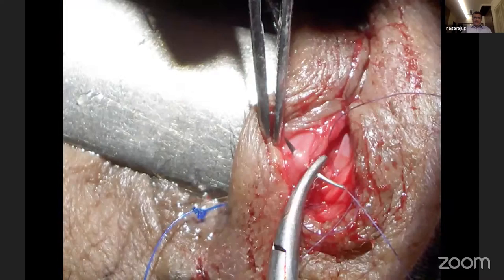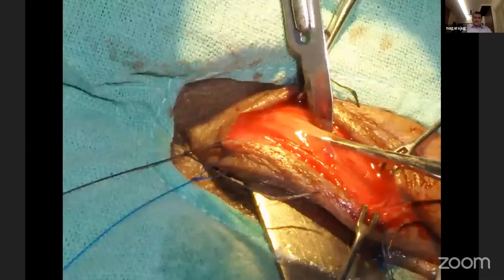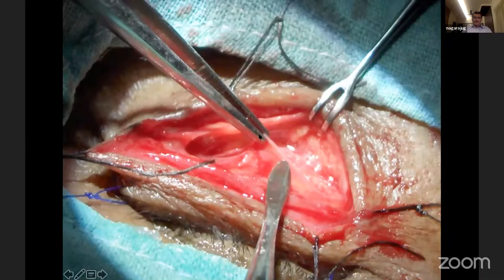And basically, when you identify the inferior retractors of the lids, you hold the lid with a non-toothed forceps, you hold the inferior retractors here, and you ask the patient to look up and down. You can just feel that tug whenever the patient moves the globe from an upward to a downward position. That is an indication that you have caught the structure right. Only if you identify this structure by this particular test can you get very good surgical results. Without that, sometimes you might just suture the conjunctiva or the orbital fascia, and you think you have done a Jones procedure, and that will produce a failed surgical result, which might require a resurgery also.